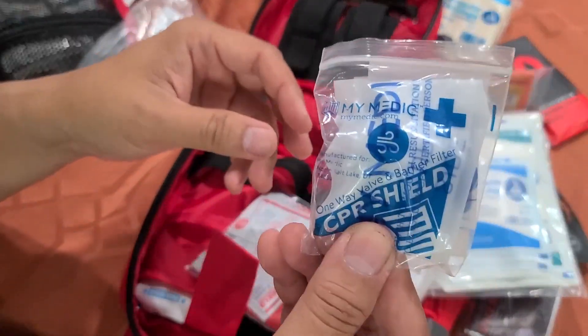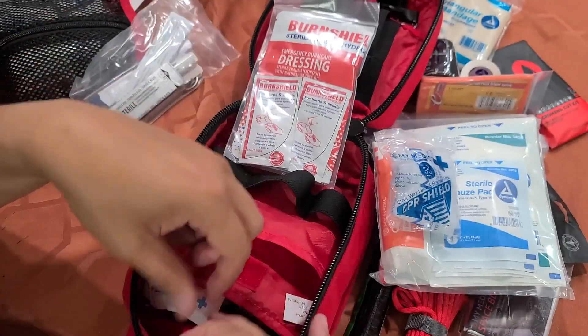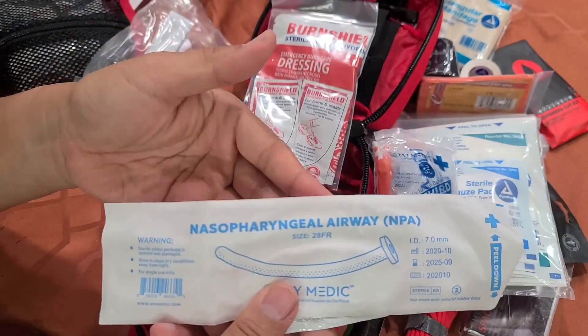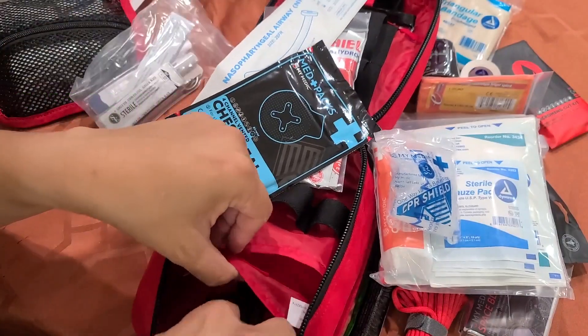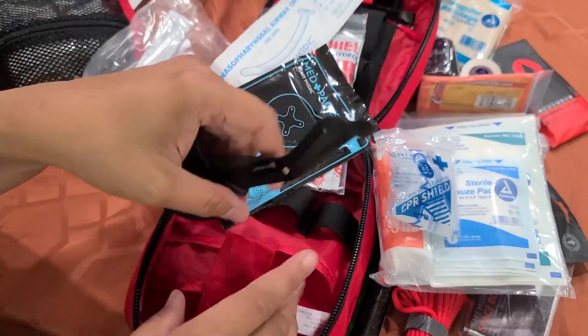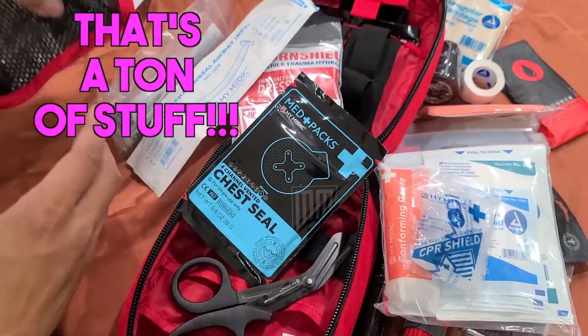A CPR shield. A burn shield for burns. A nasal airway passage. A chest seal — that's part of the advanced kit, very important. Emergency shears to cut open clothes if you need to get at wounds. All that stuff is in this little tiny pack.